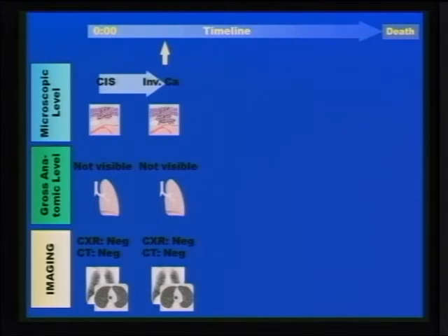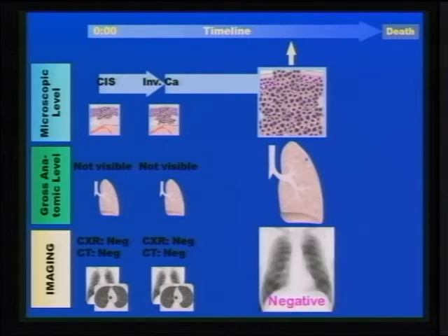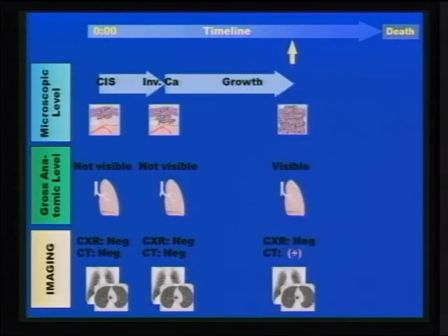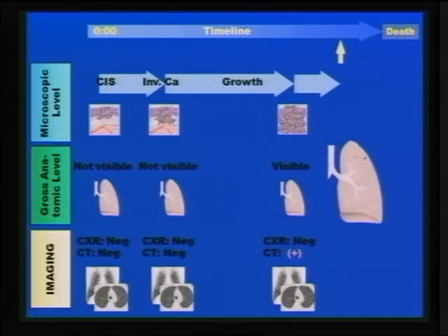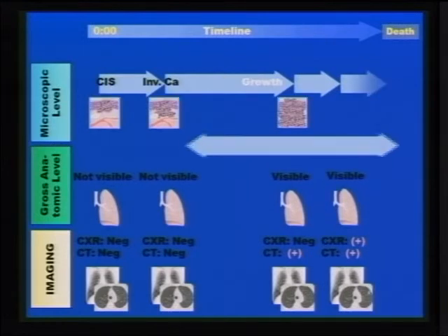I have only 2 more minutes, if it's okay. But just to point out that 2/3 of the life of the cancer we're not going to see. And actually, the nodule is going to be invisible basically on chest X-rays and then probably to a lesser degree on a CAT scan. But it's not until it reaches a certain size in advanced life of the cancer that the radiologist can play a role. So this has an impact on screening and what we can do as far as screening and when we need to intervene, when we're not to intervene.